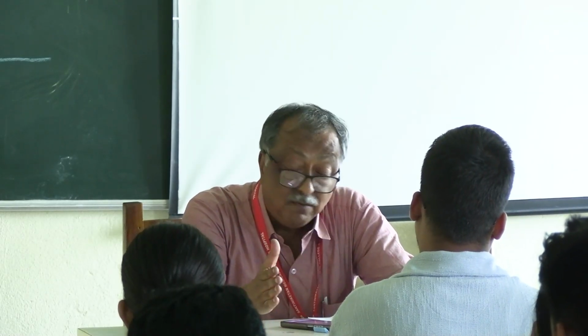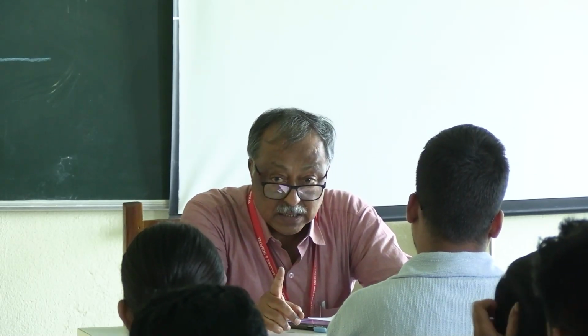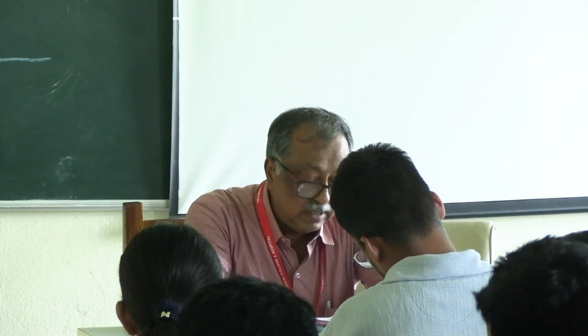When we say the conversation test, we should mention again those things. It is 40 feet distance or 12 meter for the conversation, and for the whisper it is 6 meter or 20 feet distance.